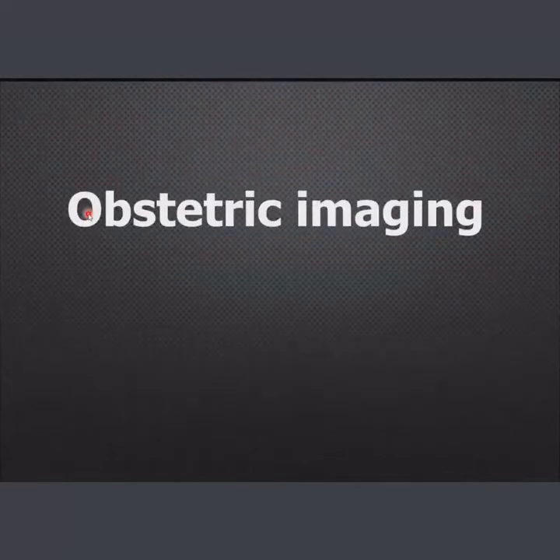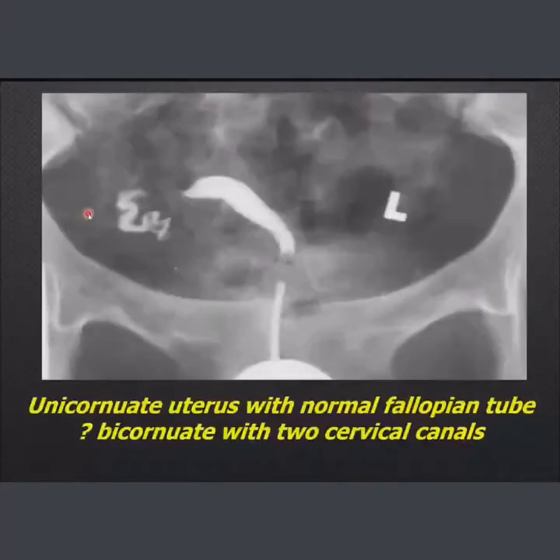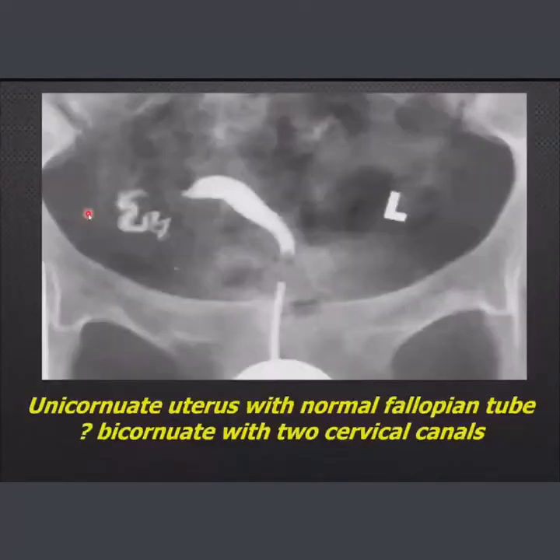هذه بالنسبة للغينيكولوجيكال imaging. حكينا a few points عن الأوفيريان سيست وركزنا عليها والتايبس مالتها والديفرنشيشن بين benign and malignant lesions وحكينا عن general idea about gynecological malignancies وعرفنا role of imaging modalities وشو كنا نستغلها. وعرفنا انه الـ MRI يزيد لنا الـ confidence is this benign or malignant. فبالنسبة لليوترس والسيرفكس it is used for staging okay local staging.